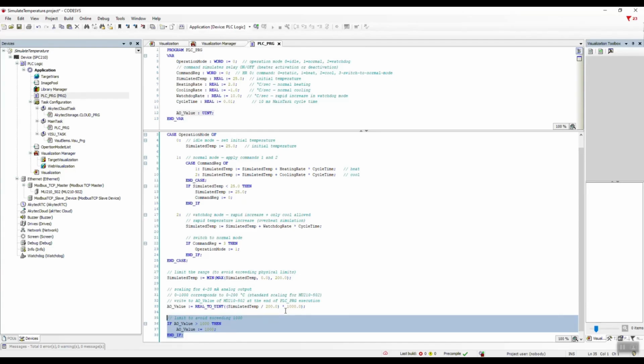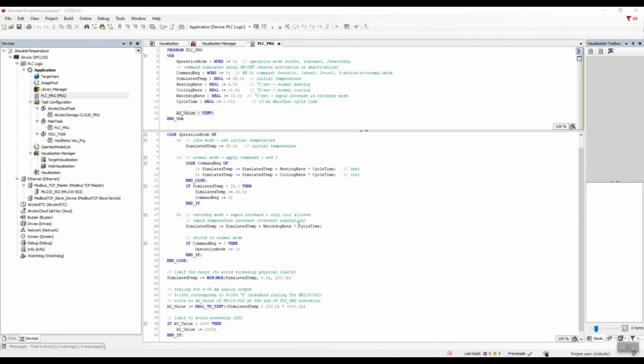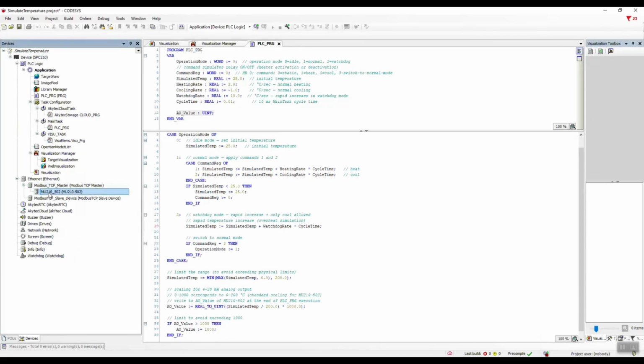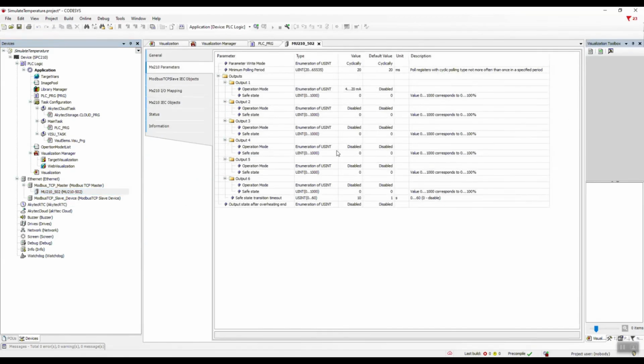Let's move on to the second topic, how to set up interaction between the main project and the emulator project. Now, let's add the analog output module template MU210-502 operating in Modbus TCP slave mode to the device Modbus TCP master. In my example, this template has already been added. It allows you to emulate the process of changing the temperature inside the sterilizer.